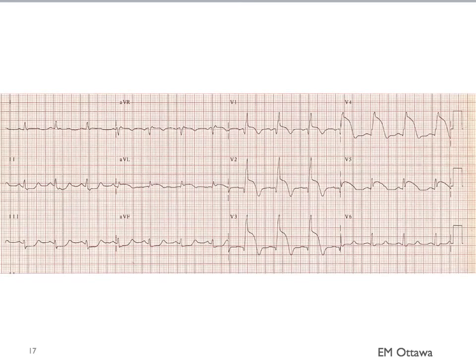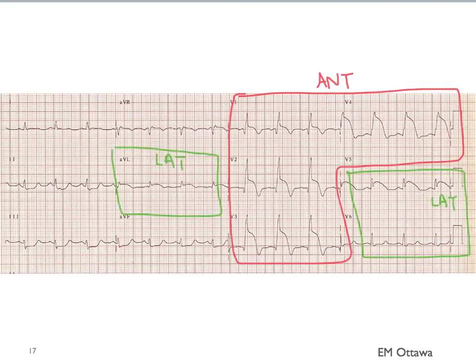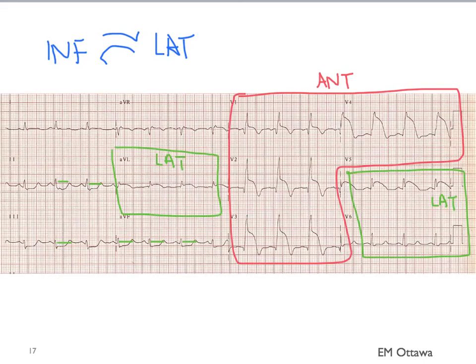What about this one? You notice that there are ST elevations in the anterior leads and the lateral leads. Do you see any ST depression? You can see ST depressions in leads 2, 3, and AVF, corresponding to the inferior part of the heart. That makes sense because the inferior part of the heart reciprocates with the lateral ST changes. In a standard 12-lead EKG we don't do posterior leads, but if we were to do them using a 15-lead, we would be able to see ST depression in the posterior leads.